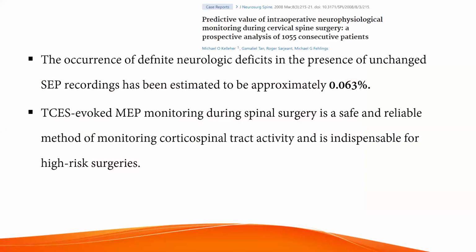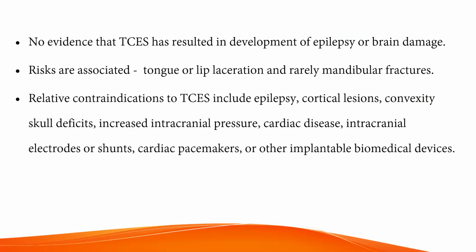The occurrence of a definitive neurological deficit in the presence of unchanged SSEP intraoperatively has a possibility of 0.063%. And transcranial evoked MEP monitoring during spinal surgery is a safe and reliable method of monitoring corticospinal tract activity and is indispensable for high-risk surgeries. There is no evidence that transcranial electrostimulation has resulted in the development of epilepsy or brain damage. It has a risk of lip laceration and tongue laceration. Rarely, mandible fractures have been reported.